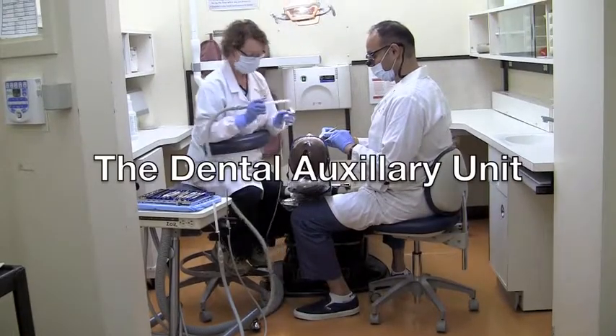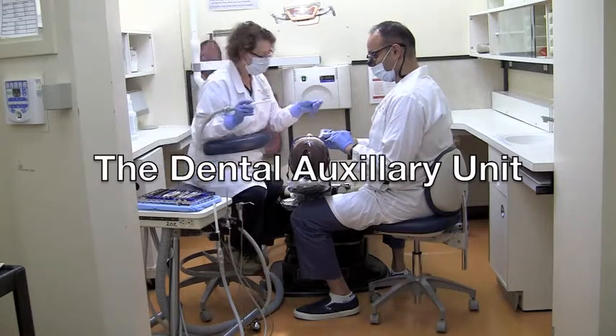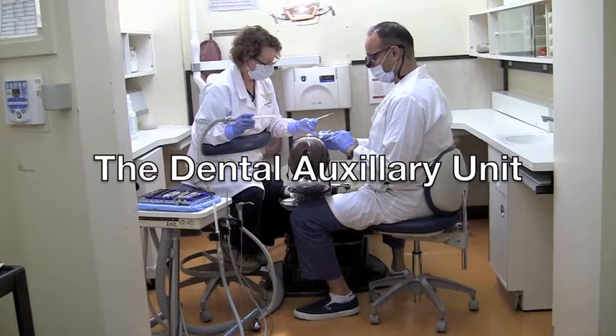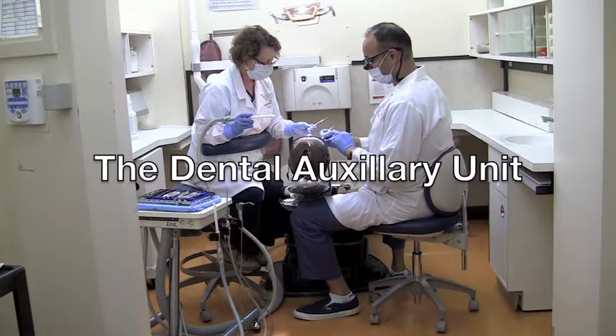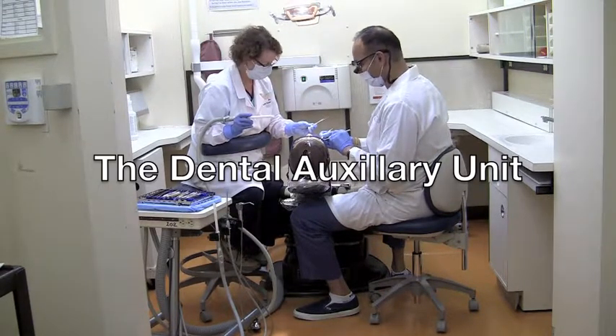The Dental Auxiliary Unit is any of the dentist's supporting team who helps in the delivery of patient treatments. A dental assistant plays a vital role in the oral health care of our patients by making procedures more efficient through instrument transfers, moisture control in the operative field, as well as mixing and dispensing materials. This video will provide you with some basic skills to help you assist in the dental clinic.